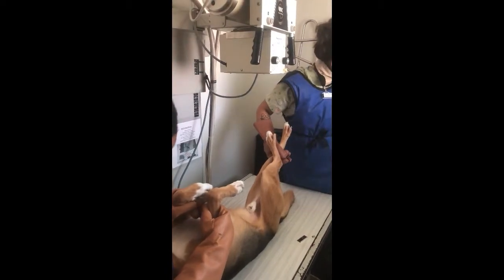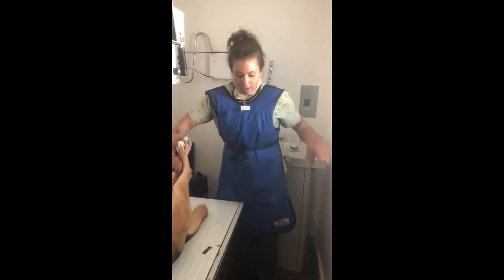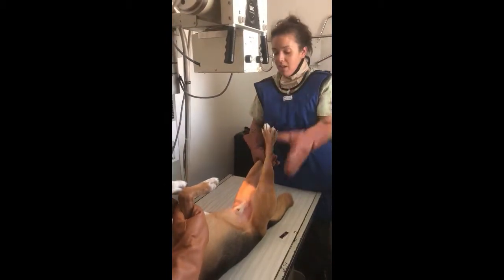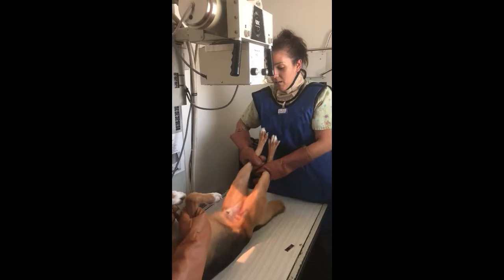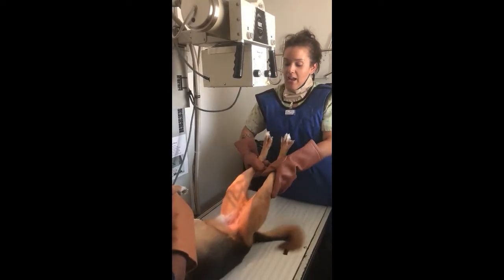Okay, so we're going to do our OFA hips on our volunteer for the day. So now that we're pretty much in position, we want to turn it on. We already have everything set. We've got our pedal within reaching distance. That gets the rotor going so it doesn't take quite so much time, so the patient gets used to it. You want to get him into the beam. Come on, relax, you're okay. Come on, Ranger.